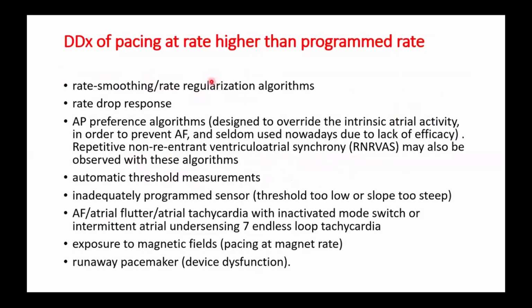And this is the differential diagnosis of pacing at a higher rate than the programmed rate. You should always think of all of these. First, the rate smoothing and rate regularizing algorithm, and this feature is programmable. Second, rate drop response, which is programmed in Medtronic devices in cardio-inhibitory syncope.